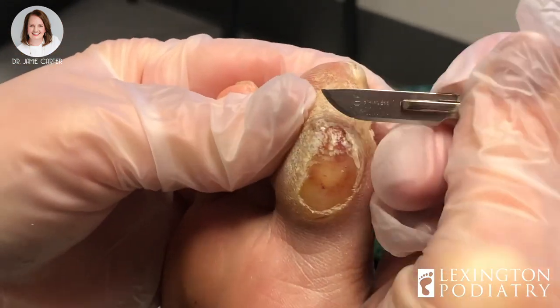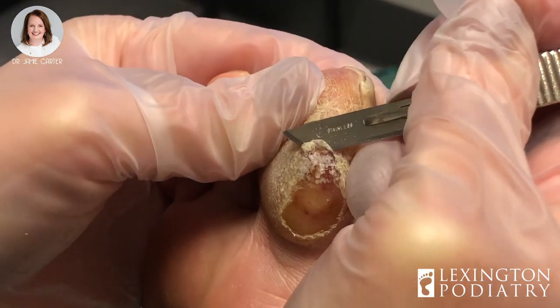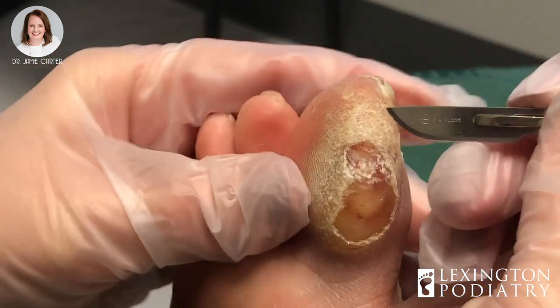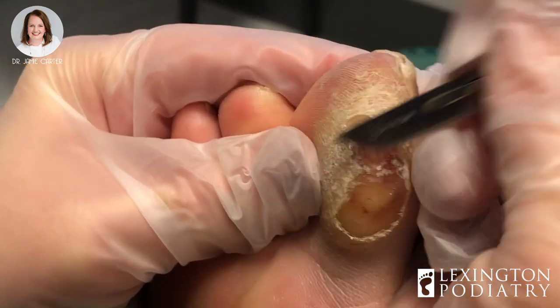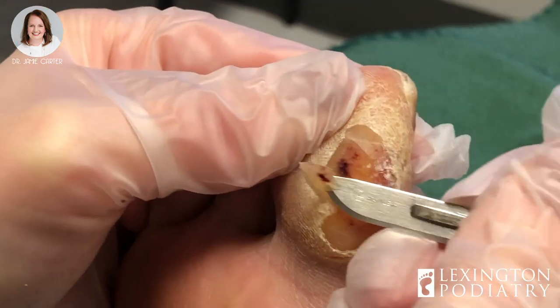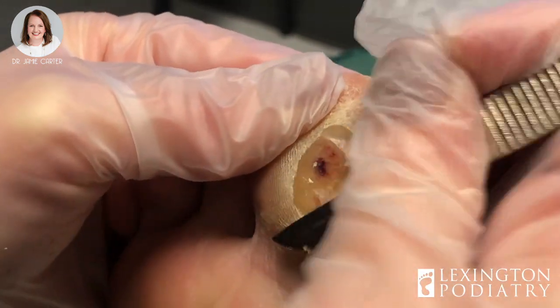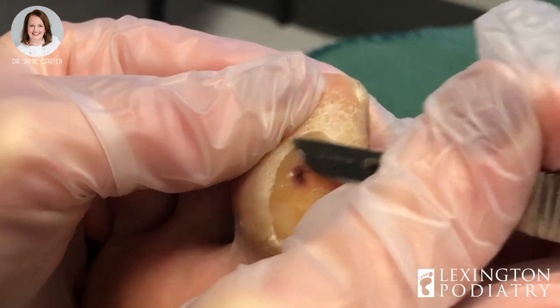I'm sure this feels so, so much better when you get it trimmed down. I feel like I'm squeezing her poor little toe to death. Normally I don't use a blade handle, but sometimes when a callus is very thick I need a little bit of extra leverage and the handle helps me to do that.